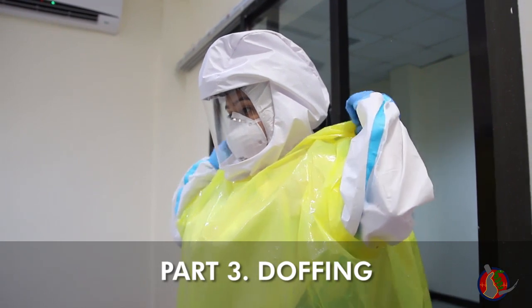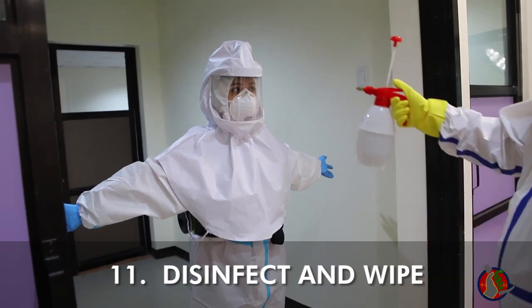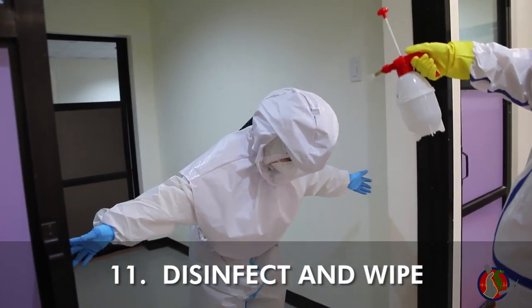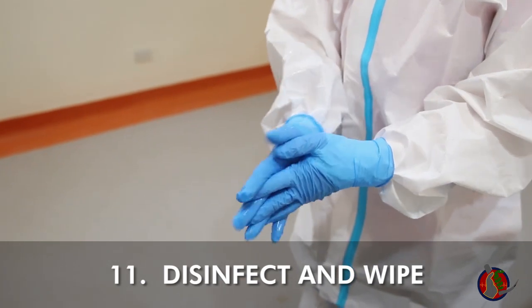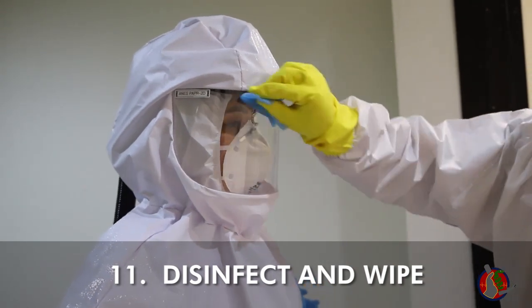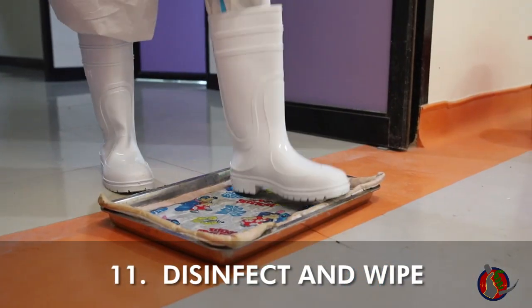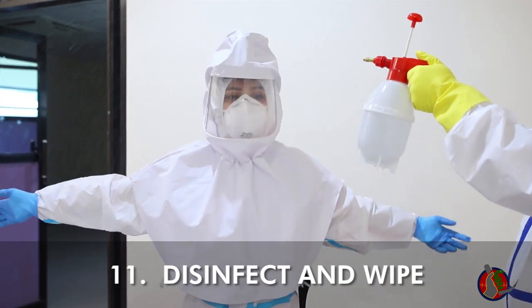PAPR doffing is done at the doffing area after second stage doffing is complete. Buddy in enhanced PPE sprays alcohol in the T position and wipes all over the user, from hood to sole, to include the PAPR belt, breathing tube, and motor unit. Do hand hygiene. Repeat hand hygiene as necessary during doffing. Buddy wipes the hood face and area around the hood, then sprays and wipes for a second time.